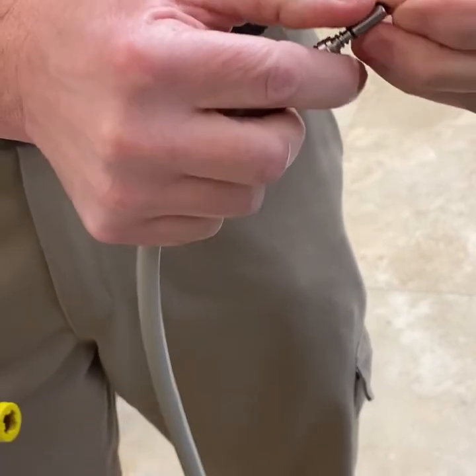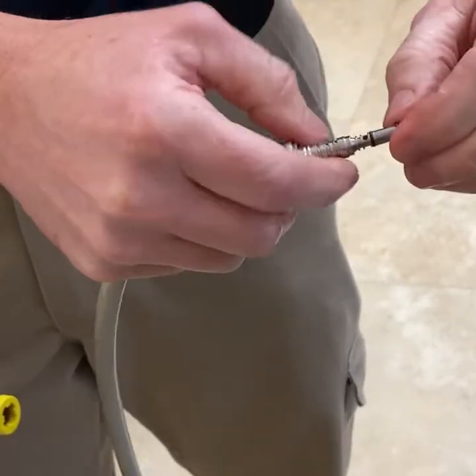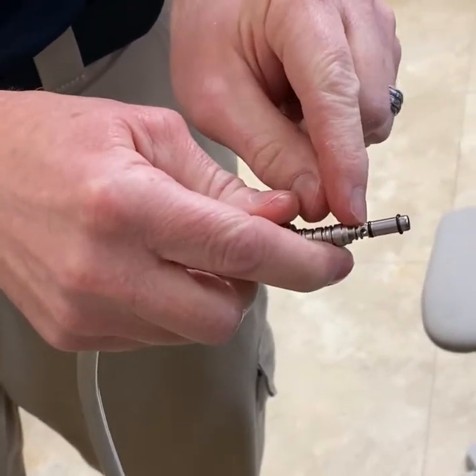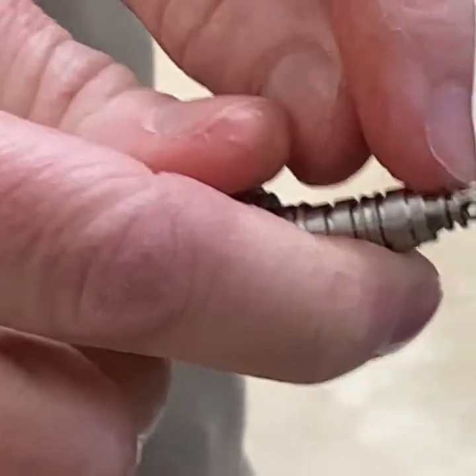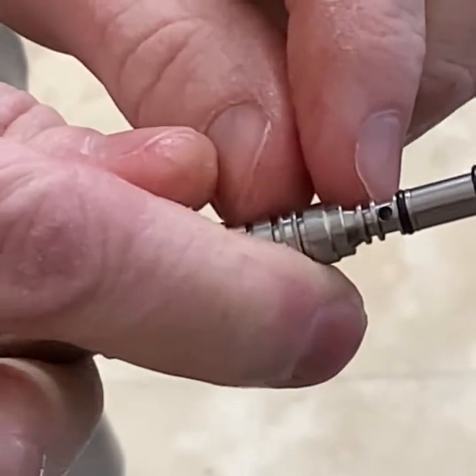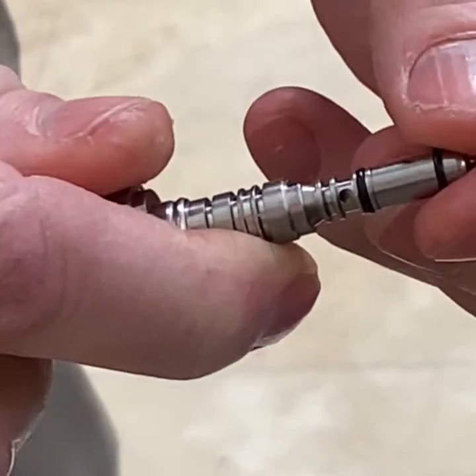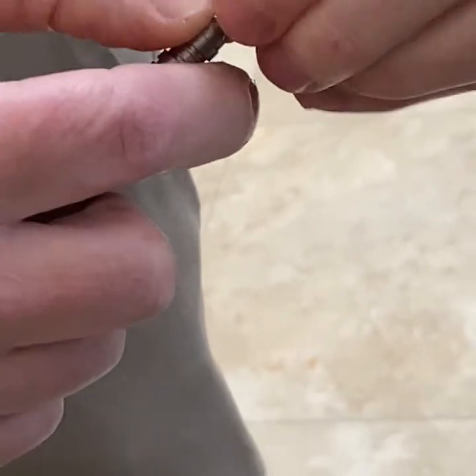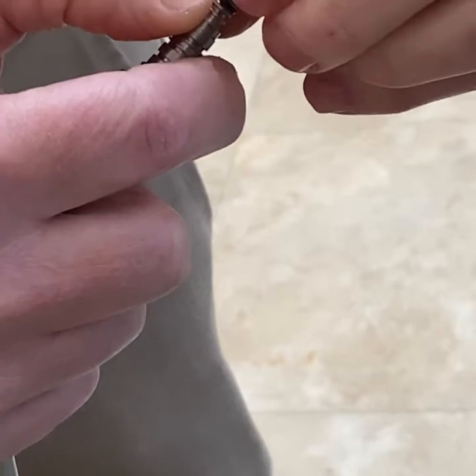These o-rings fit in the little channels on the coupler. I've got my top o-ring on — if you look in the middle channel you'll see a hole. You don't want to cover that up; that's not where the o-ring goes. If you cover that up you won't get water coming out. So you slide it past that hole and it fits in the next channel.